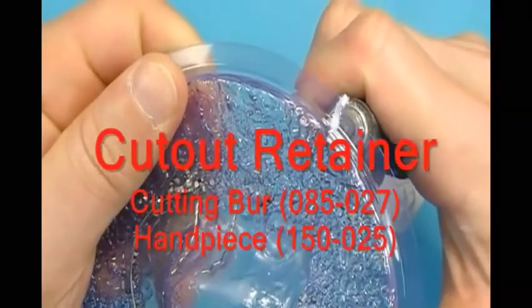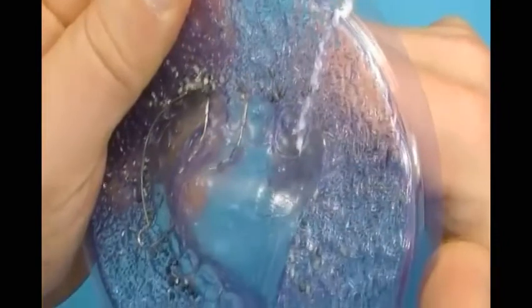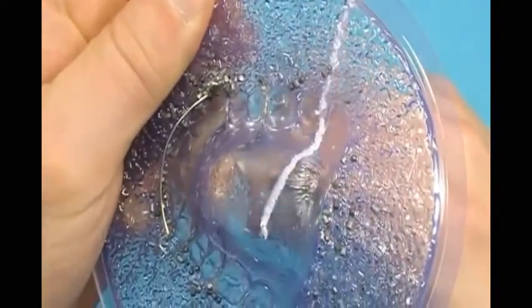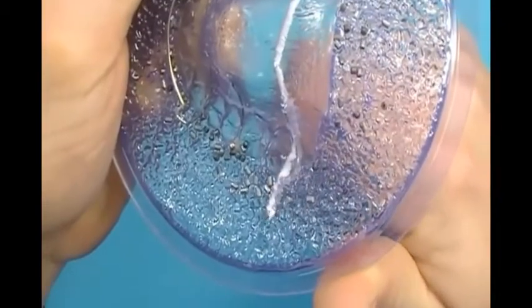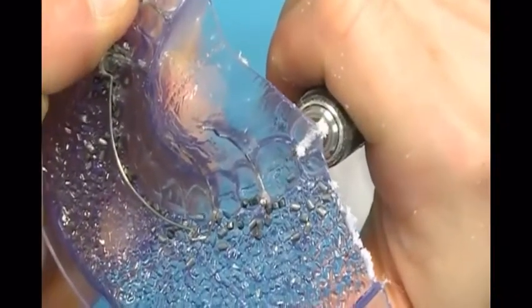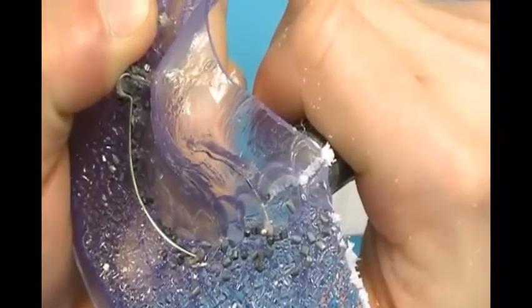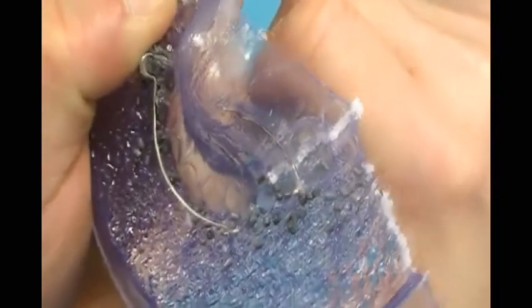Using a carbide cutting burr and lab handpiece, cut out the retainer from the disc. Start by cutting along the back of the appliance at the first or second molar reference. Then cut along the lingual cusps of the posterior teeth and near the incisal edges of the anteriors. Caution must be used around wires that are embedded in plastic.